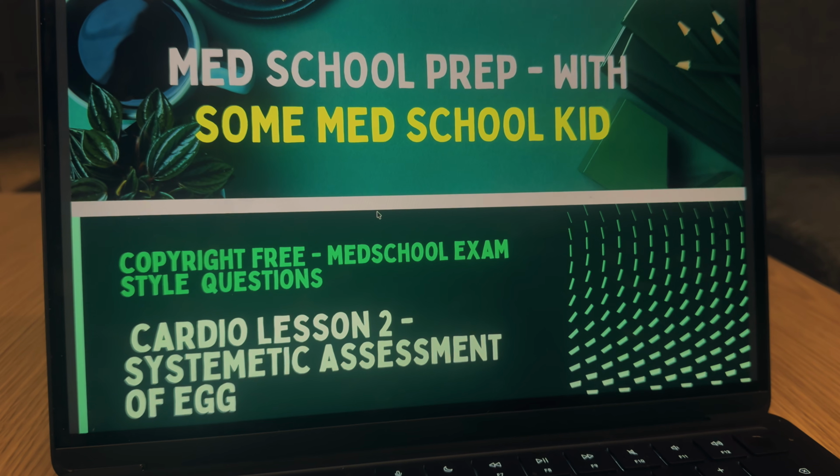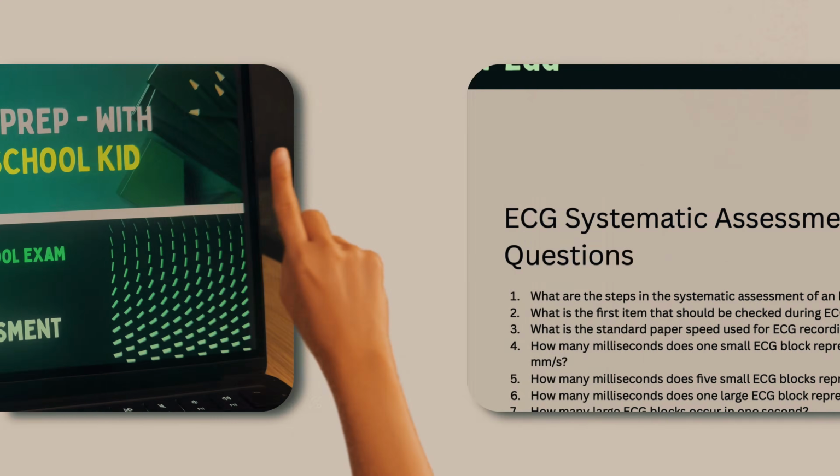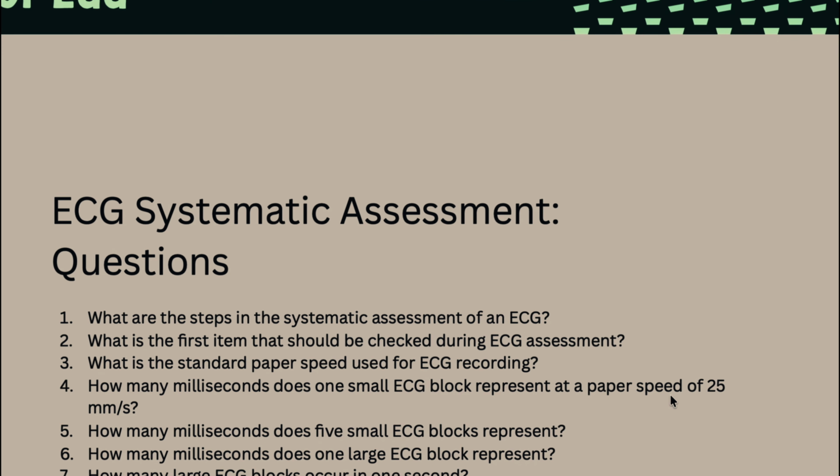Let's solve some questions on the systematic assessment of ECGs. Solving these questions will hopefully help you to have a better understanding of what the systematic approach of solving ECGs would be. So let's look at question 1. Question 1 asks, what are the steps in the systematic assessment of an ECG?